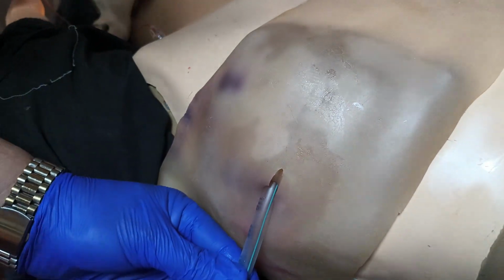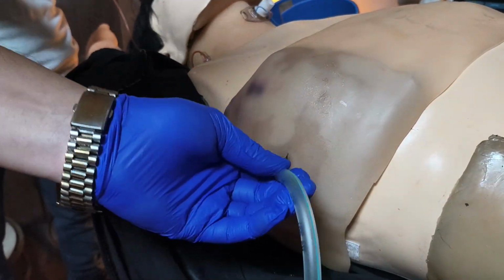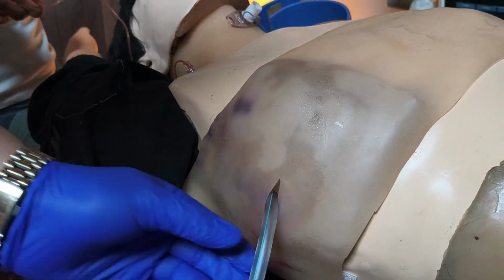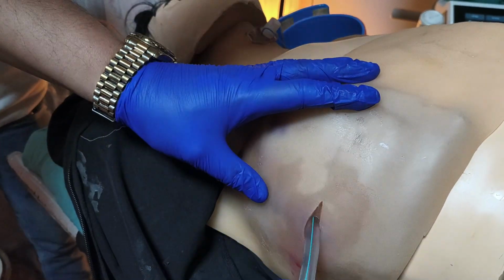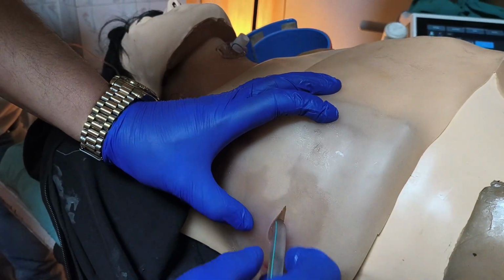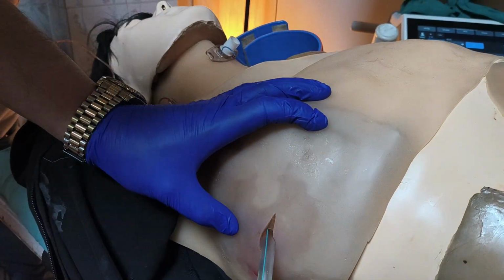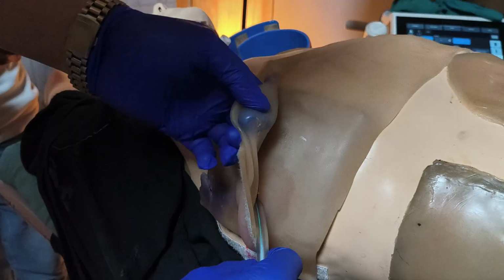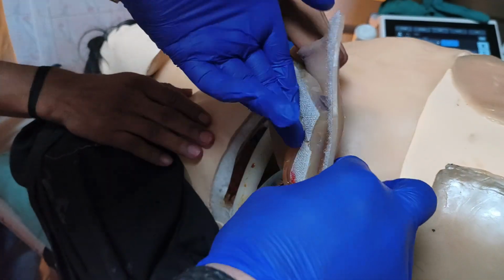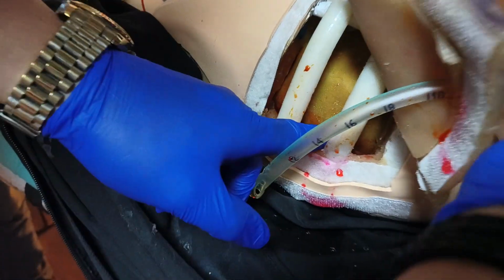So now the whole blood has been drained. Okay, this is slightly messy, but okay. So you can see the lung also.